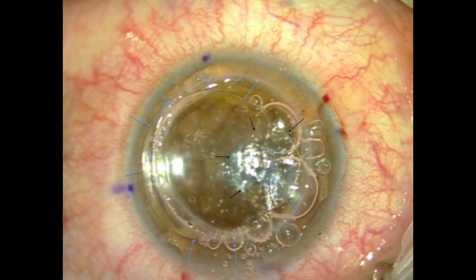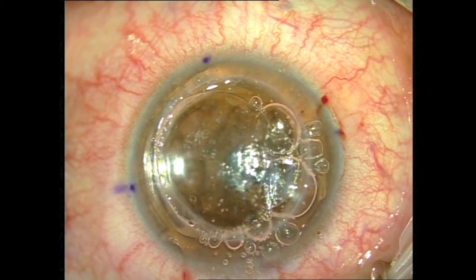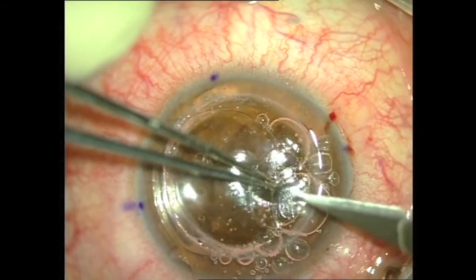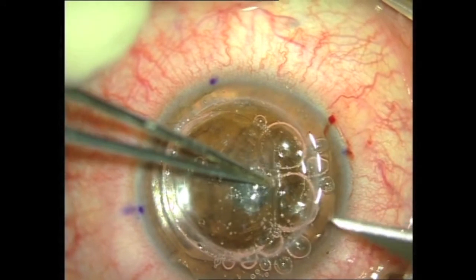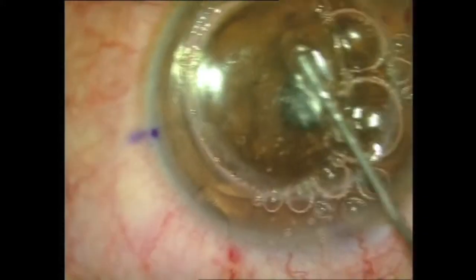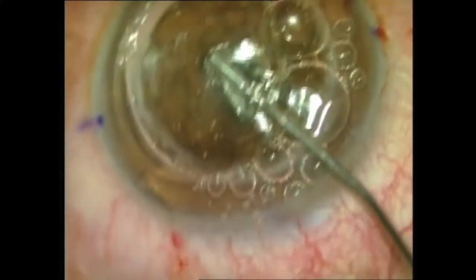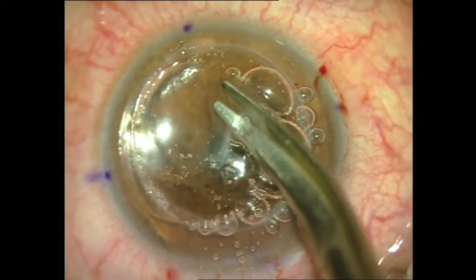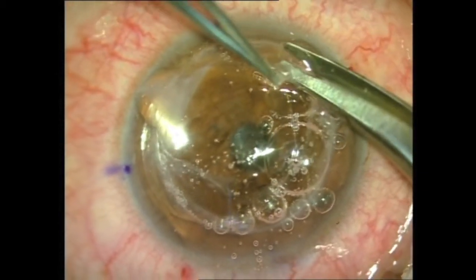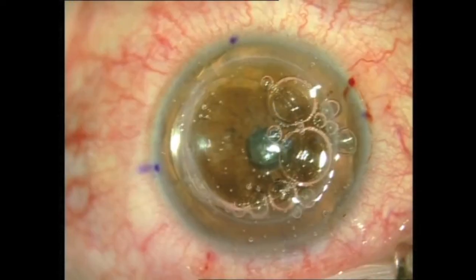Now I am going to incise the stroma over the type 1 bubble using a super blade. After incising the stroma over the type 1 bubble, the viscoelastic cannula is introduced through the created hole to complete dissection in the desired plane. The stroma is then divided and cut till the trephination groove.